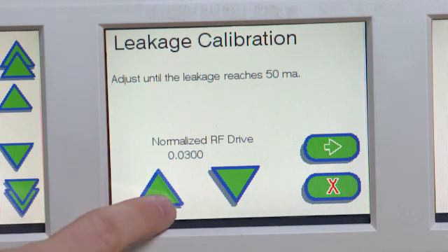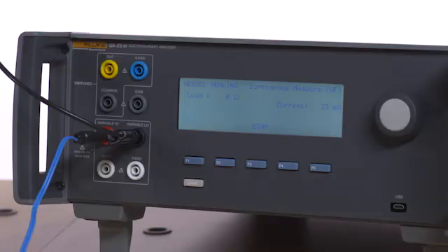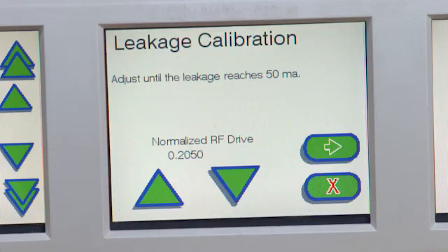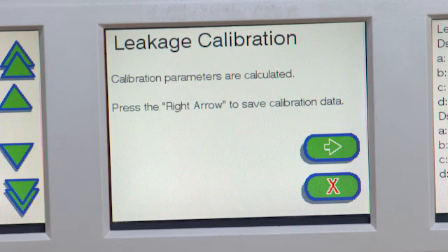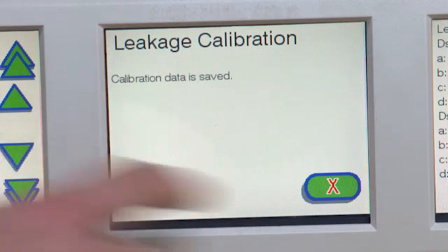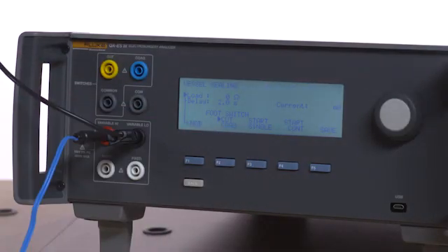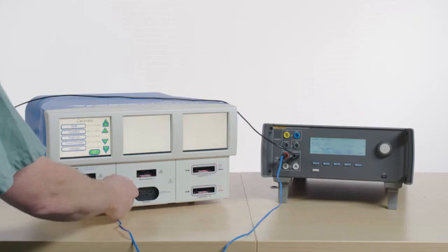Follow the on-screen instructions to perform leakage calibration. When on-screen calibration instructions have been completed, press the red X to exit. Press F3 on the QAES-3 to stop the test. Remove all test leads.